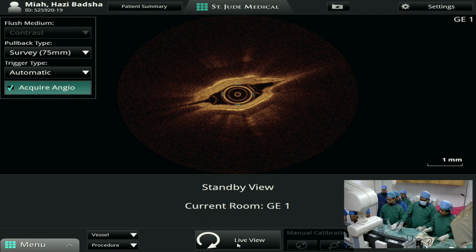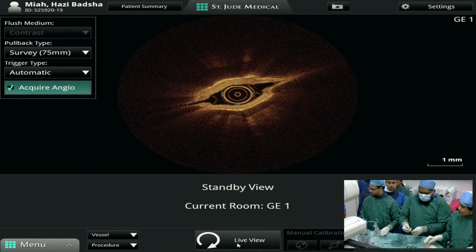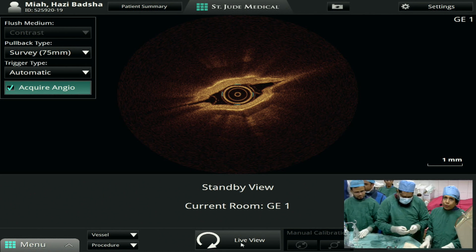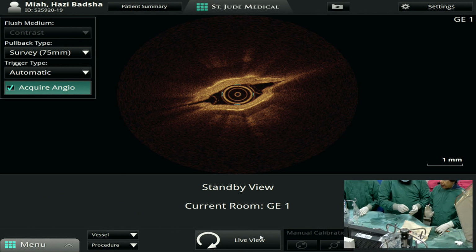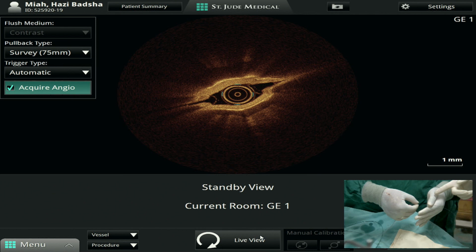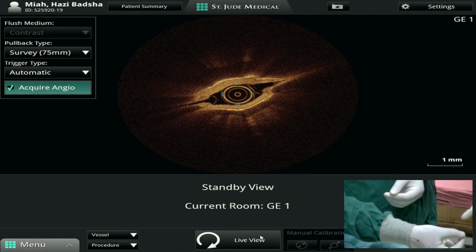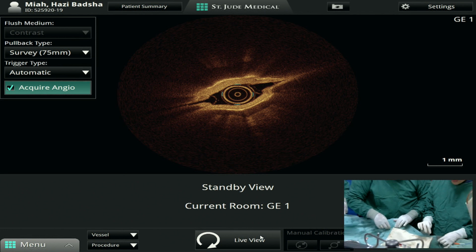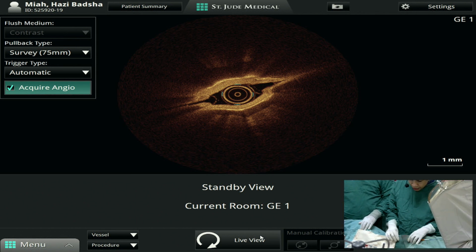So we'll put this catheter in, and you have to be so gentle with it. It's such a fragile catheter that it tends to break, and it's very, very expensive. It's one of the most expensive things that you handle, and you have to be very respectful of the catheter. So he's doing a very good job. You can see he put it in and it comes out very quickly, not like a balloon which comes out very late. So it's gone in and you can see the light sparkling there, and he covered that light to see whether it was working, and it did.